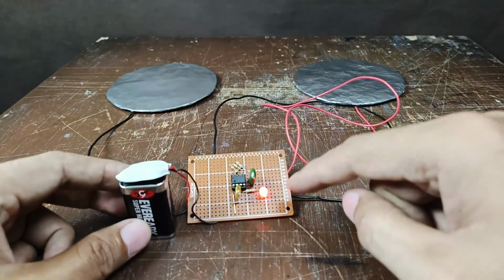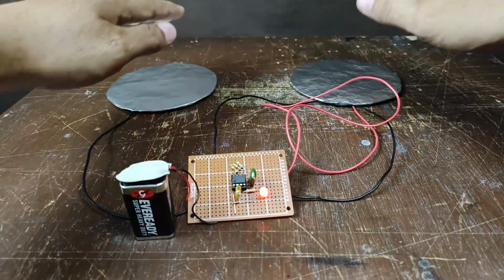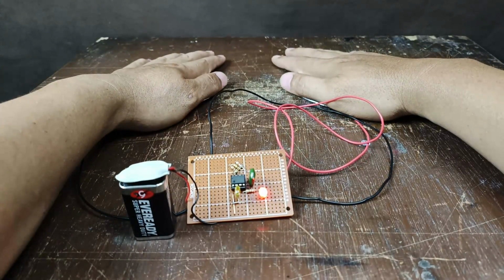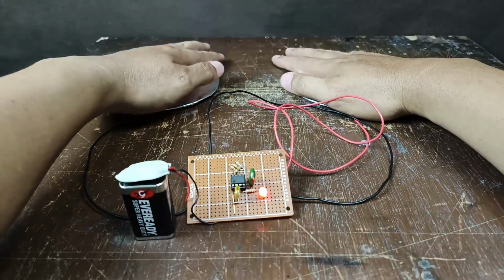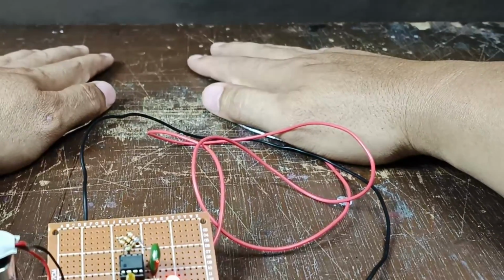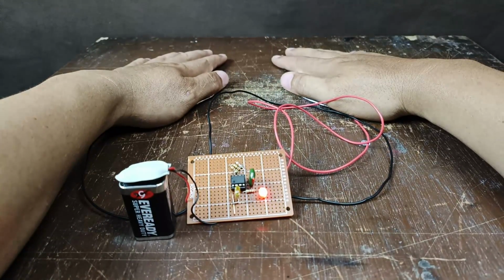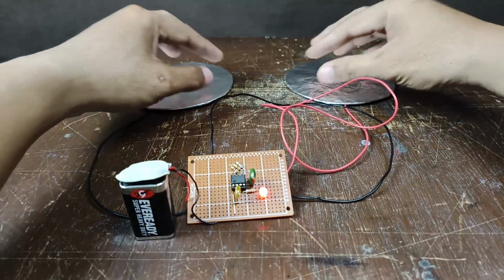So it's already turned on. Then if you have a gel or Vaseline, you can place it here so that it can conduct more current. Now I can feel the current, and just take a look at this part of my hand, my nerves move. There. I did not move that, but my nerves, there, it's moving. And I feel the current.